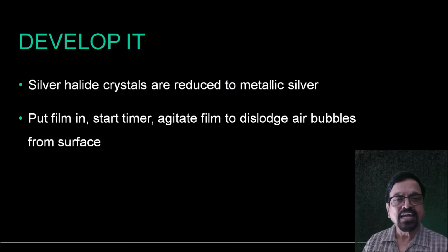Why you should do it, there are two things. One is that every time new developer will come in contact with the film, and number two, there can be trapped air. Trapped air will get removed with the help of this agitation.